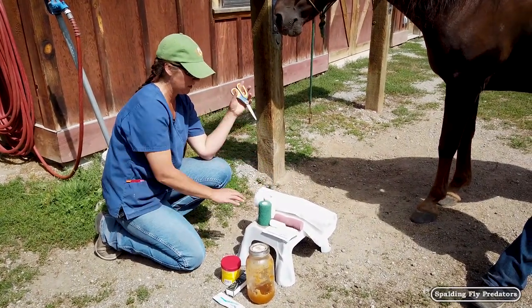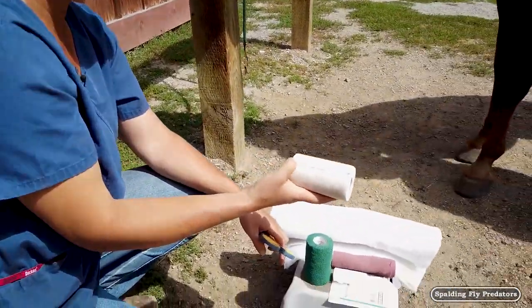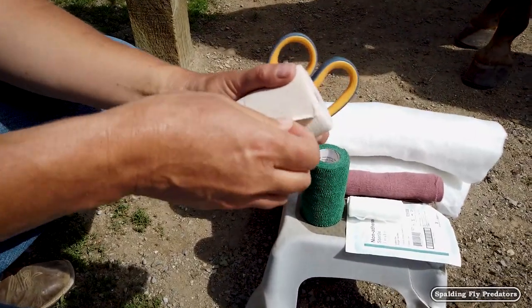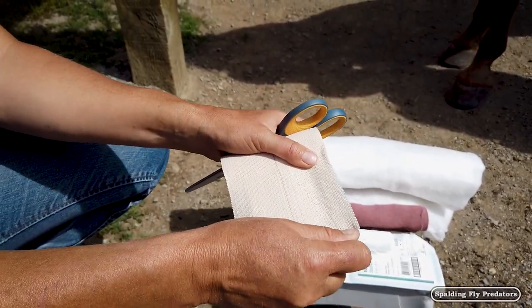Then we seal our bandage with this lovely elasticon, and Carolyn will show how she seals both the top and bottom of the bandage with this nice stretchy, sticky ace bandage that's got some give in it.